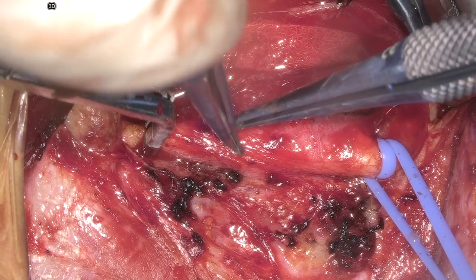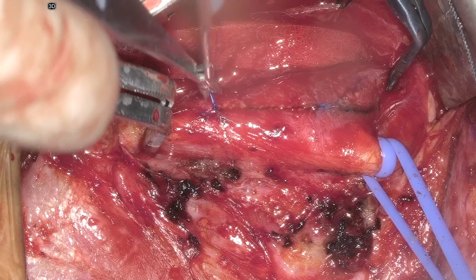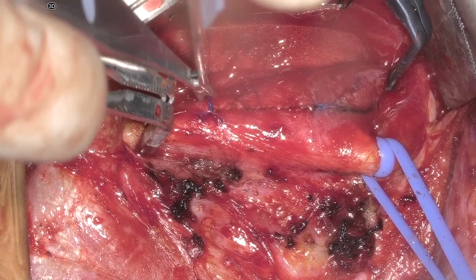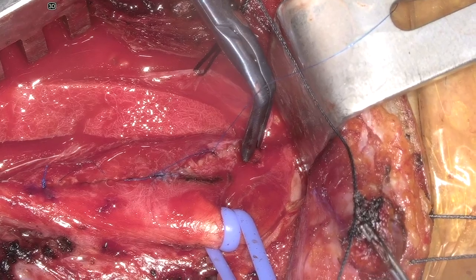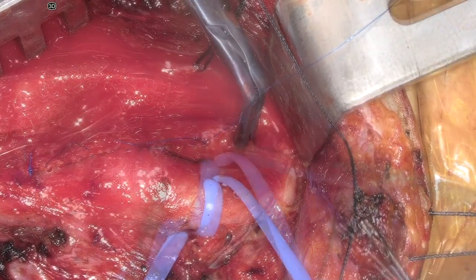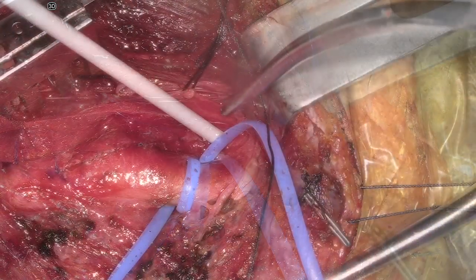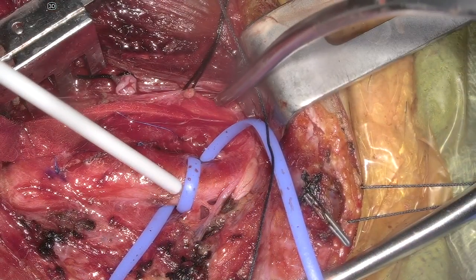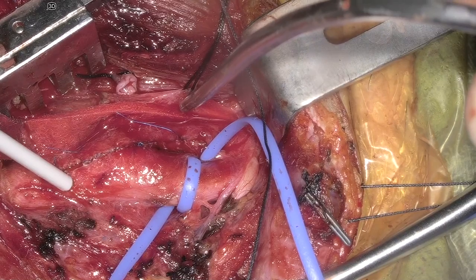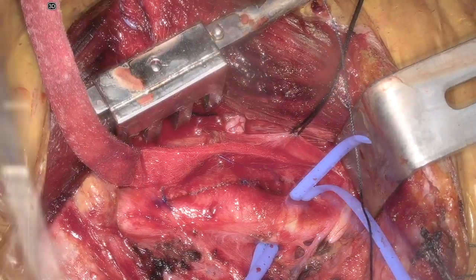First we take off the common clamp, which we're releasing now, and you'll see the bleed up the external. We loosened the external, and then released the internal after some common and external circulation. Checking with Doppler, we had an excellent Doppler signal suggestive of a widely patent vessel, then completed the closure.